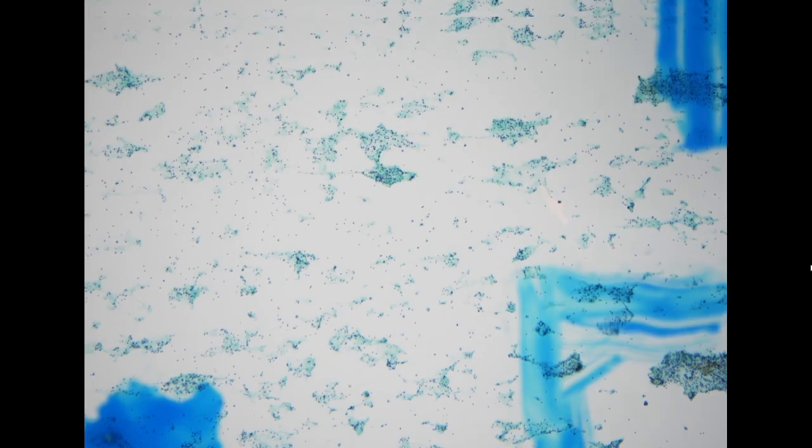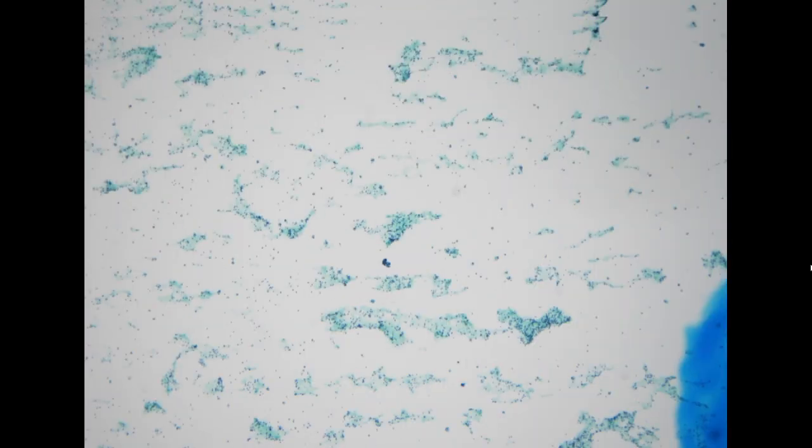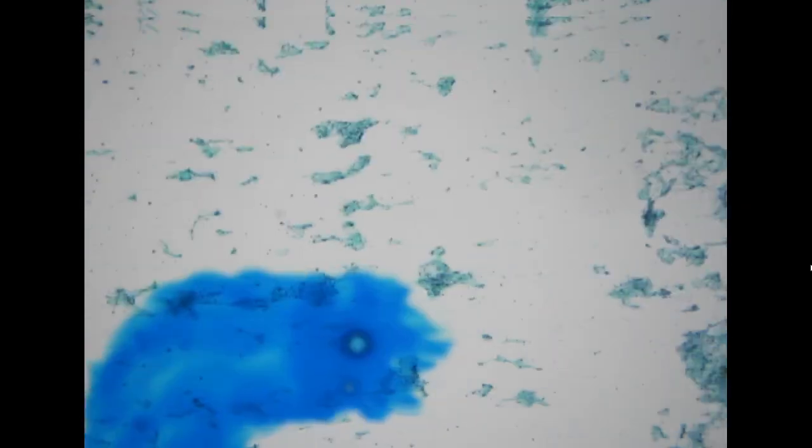He has a history of pancreatic ductal adenocarcinoma, and this is his pleural effusion specimen. In addition to pancreatic cancer, he also had a history of prostate cancer. So it's getting more and more common in our patients to have two different types of cancer.